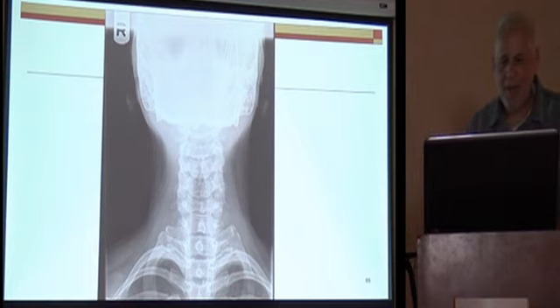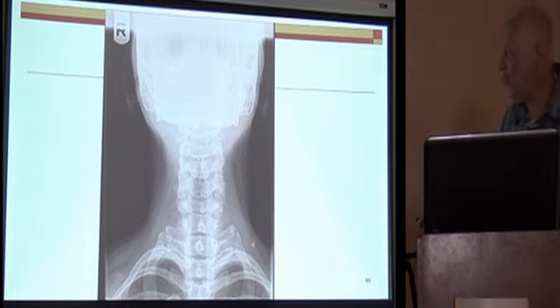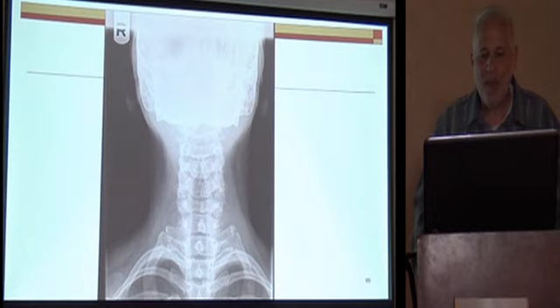And while you're doing it, I'll just make a comment or two. You notice on the CR X-ray that not only do you get good contrast between the bone and the dark here, but you also can see the muscular layers. That's because the computer knows this is soft tissue and it actually changes how it develops. That's why even if you turn it up higher and higher, all you get is more detail in the soft tissue. So you could see where you'd crank up the machine beyond what you should because you wind up dosing them more, but the picture just gets better and better.